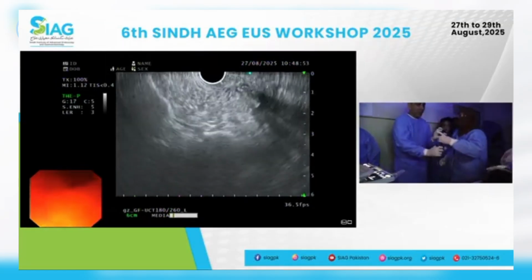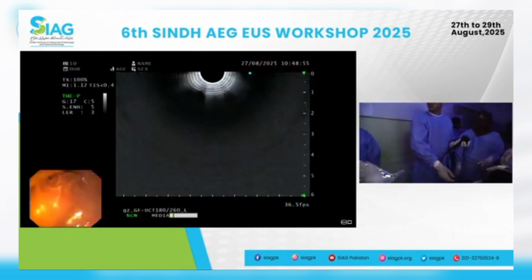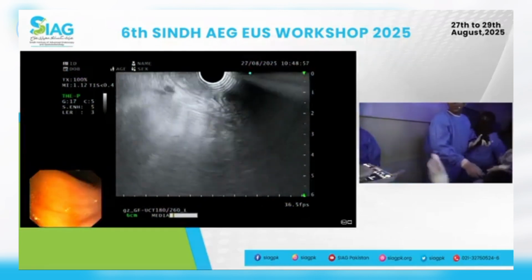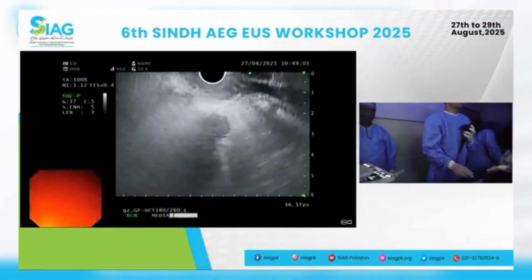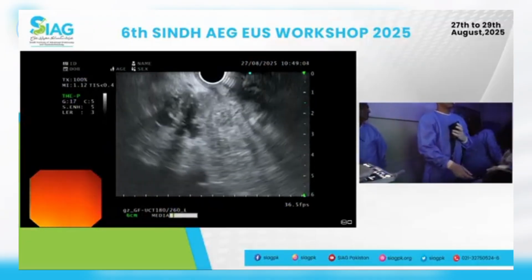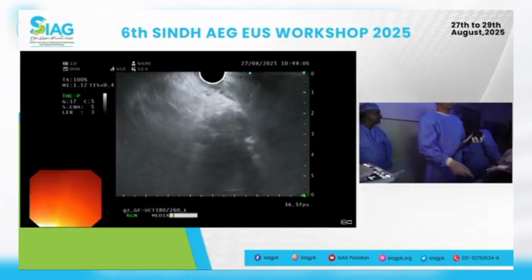Okay, don't worry, that's fine. Let me just have a look. It came back. It's absolutely fine. This is the area of abnormality.